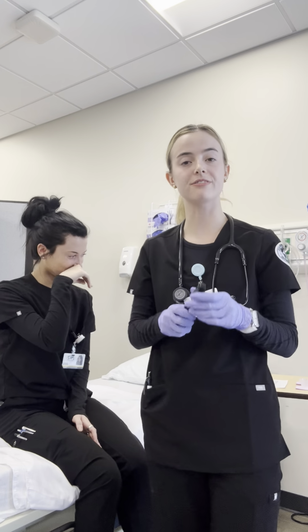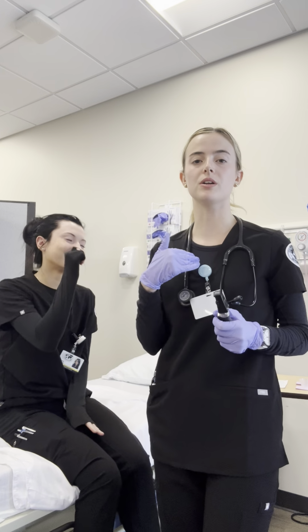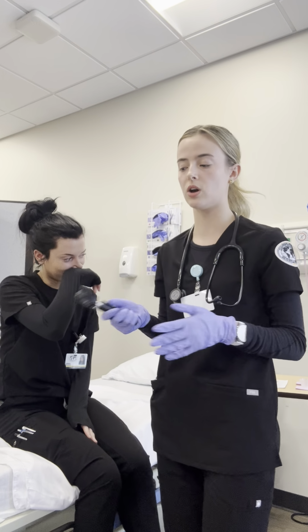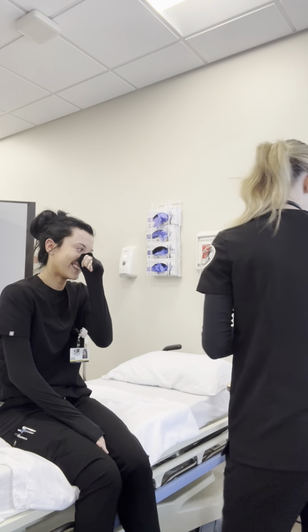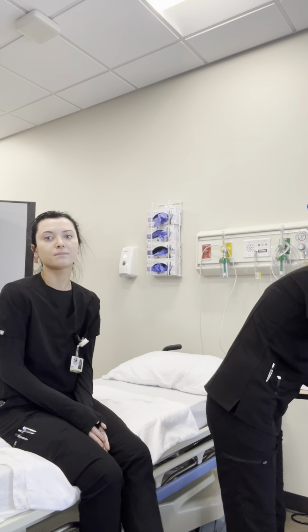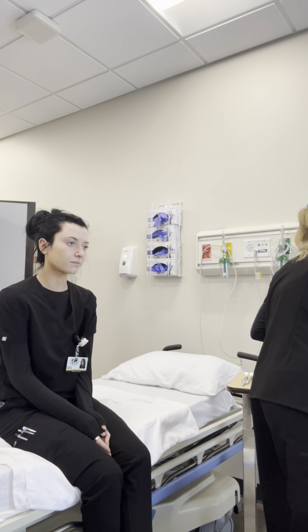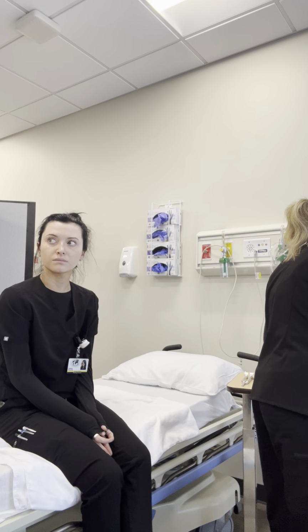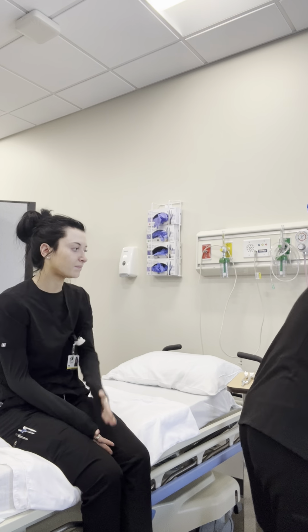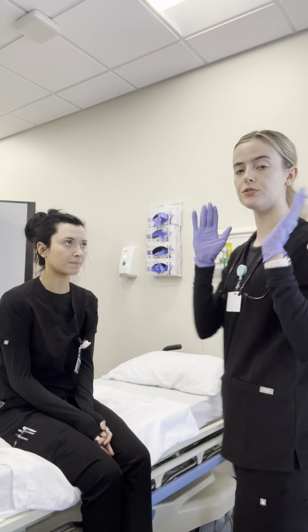Okay, so red light reflex is present bilaterally. The optic disc is cream colored with well-defined margins, and the vessels and the retina don't have any irregularities. And then I'm just going to clean this off before I put it back. So now I'm done with my eye assessment. Now we're going to move on to the ears.